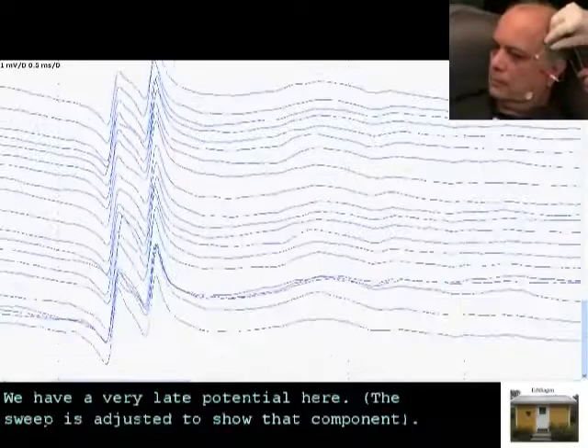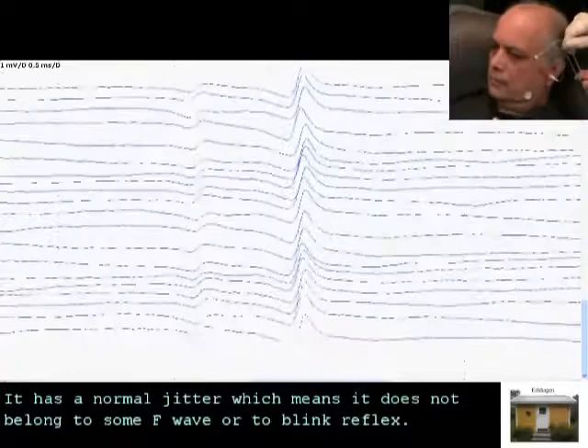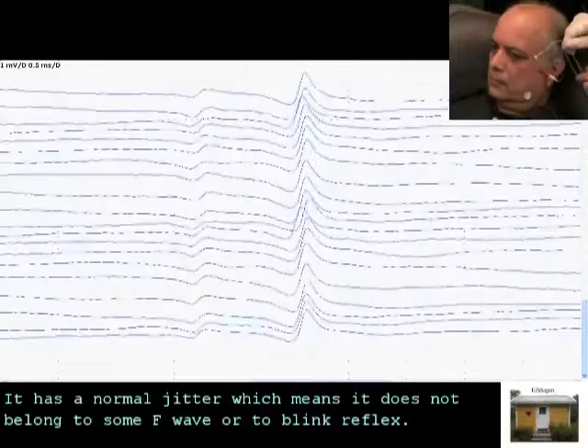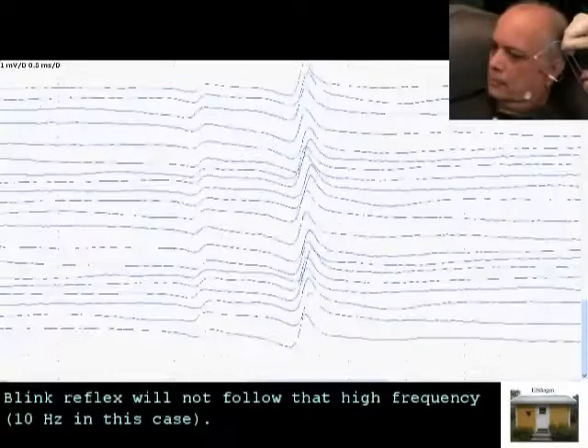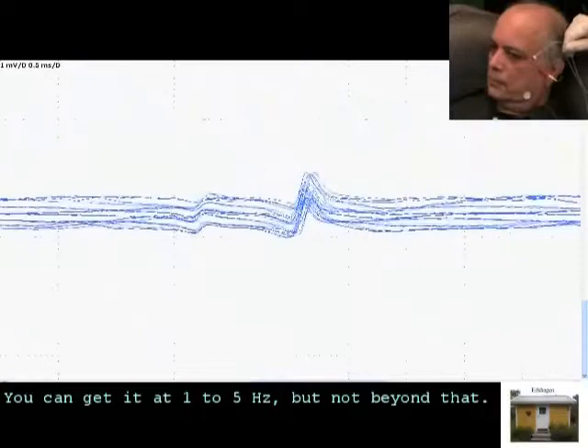We have a very late potential here with a normal jitter, which means that it does not belong to an F-wave or to the blink reflex. By the way, the blink reflex will not follow at high frequency — we can get it going to 5 Hz but not beyond that.